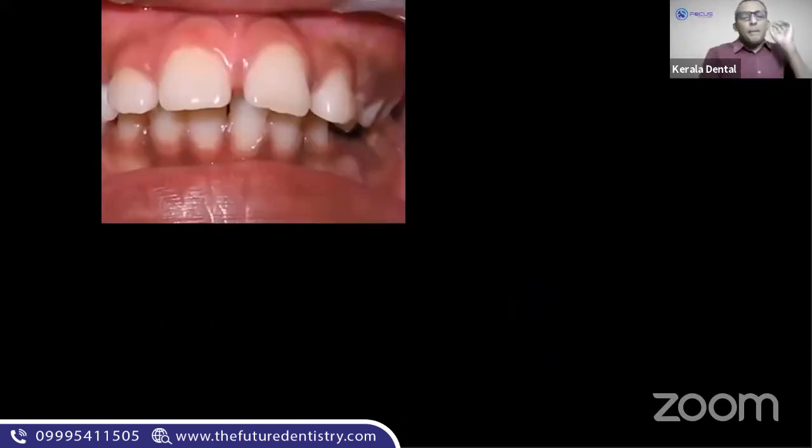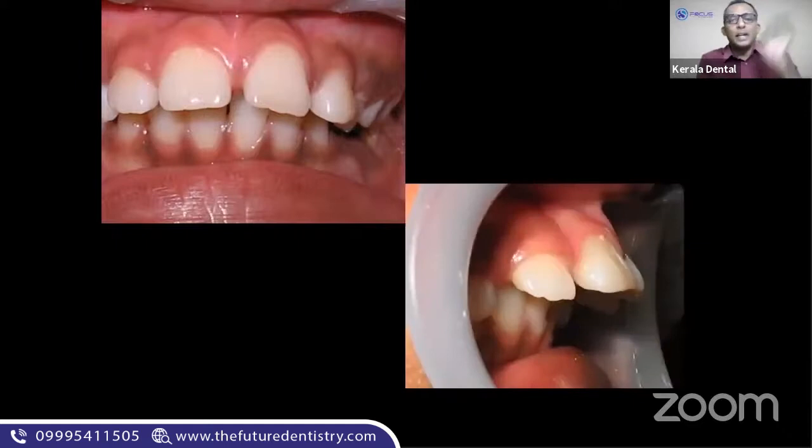Cephalometrics. Now you have a patient in front of you. Father and mother sitting in front of you with the son, 10-year-old, saying, sir, my son's teeth are coming forward. Too much forward, doctor. What do I do? Now you take pictures. You take a different picture.